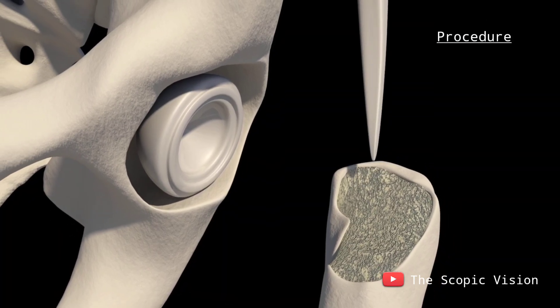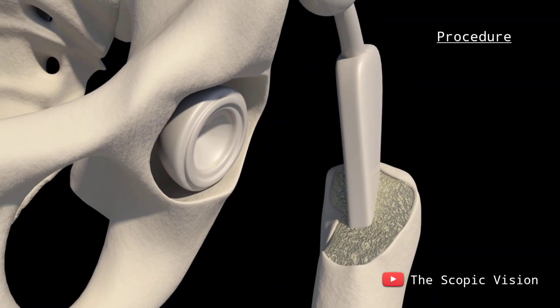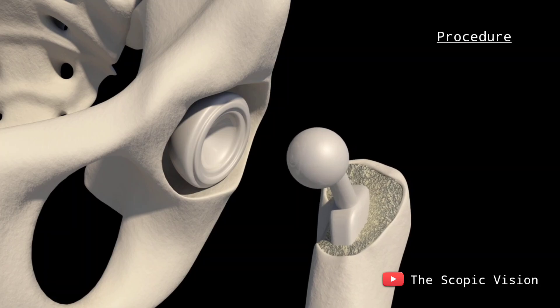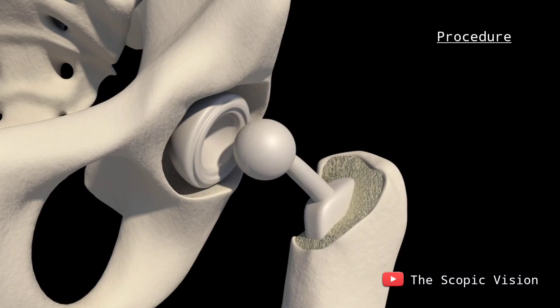Following this, the surgeon removes the head of the femur and drills into the top of the femur to create an opening for a metal stem, which is inserted into the femur. At the end of this stem, a ball made of metal or ceramic is attached, which will fit into the new artificial socket in the hip.